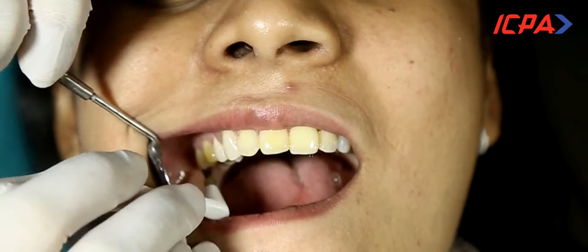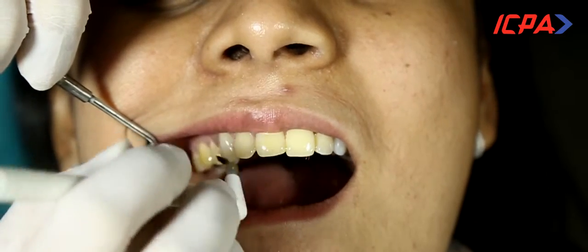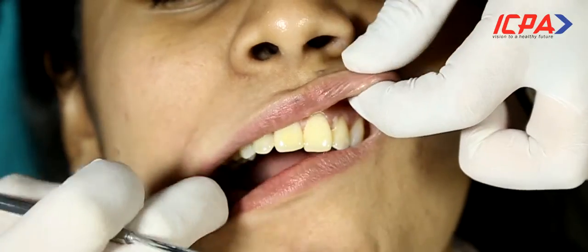And on the back teeth like this. Allow the patient to close the mouth only after it has dried. Let it stay for an hour — this will allow fluoride deposition in the enamel.